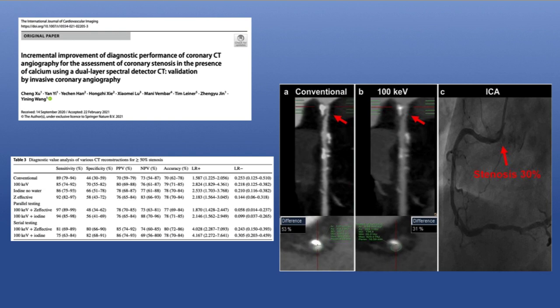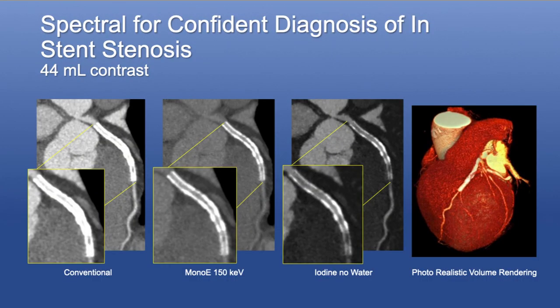So we will have at least more options, so we're not just stuck to the kV that we use to image the patient. Whether, in different patients with different burdens of calcium, which one is ideal, I think, still needs to be determined, but it takes only seconds to switch between one and the other one. We can use as well potentially dual energy CT to image patients with stents.